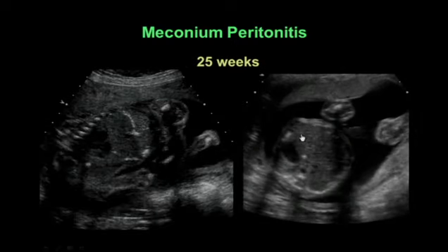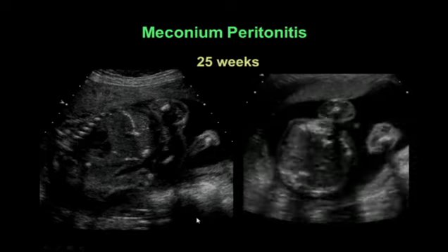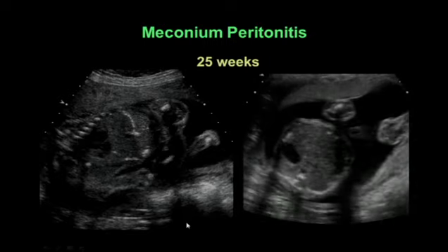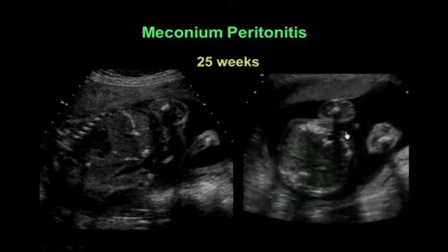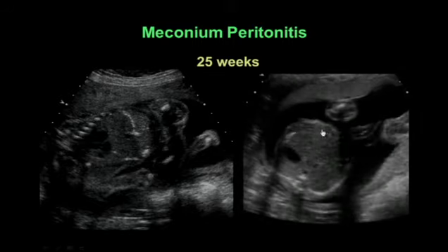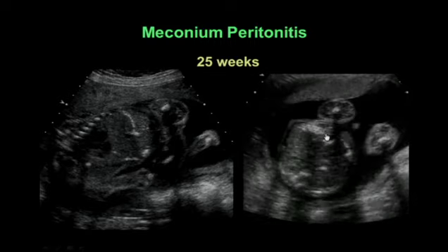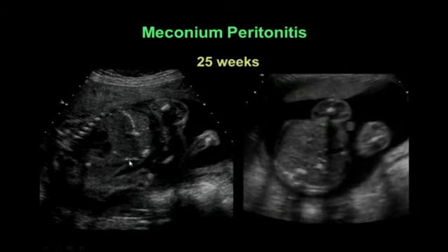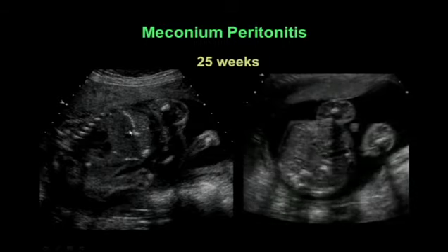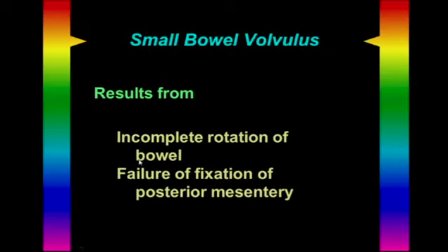By 25 weeks gestation, the calcifications were now scattered throughout the peritoneal cavity, but the cystic fluid had been completely resorbed. This clip passes through the site of the previous meconium cyst, which probably was here, and now we're left with a dense clump of calcification. But elsewhere in the abdomen, we also saw calcification, as we note here around the edge of the liver and here along the wall of the peritoneal cavity.